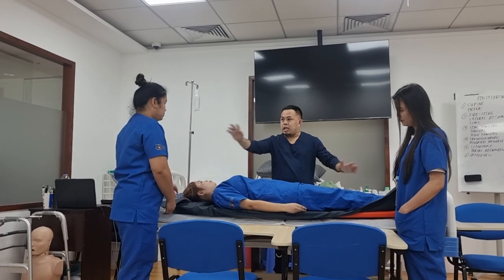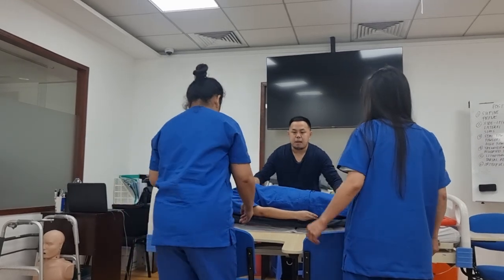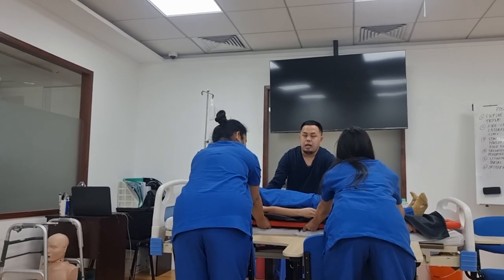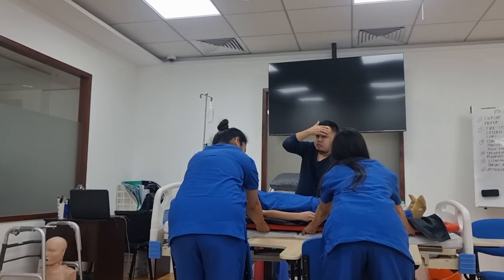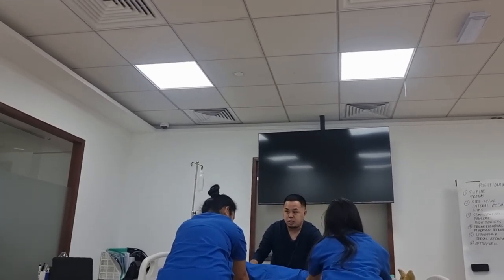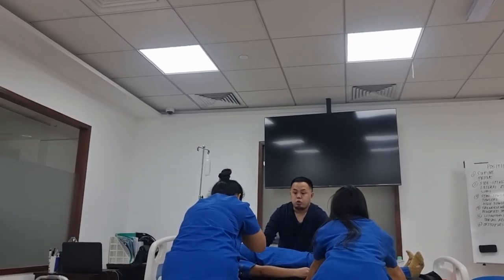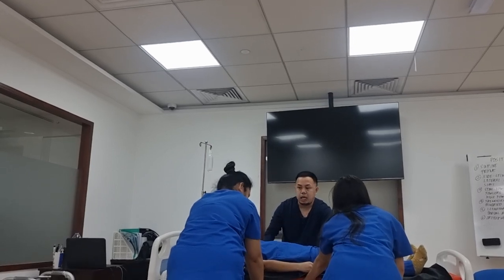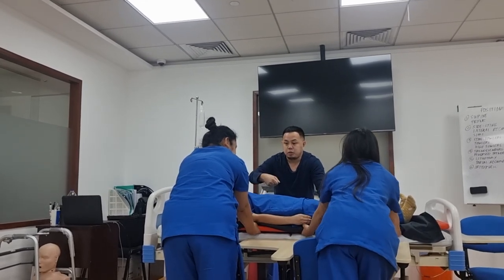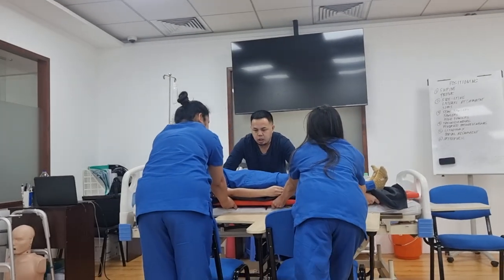Ask your colleague to stand on the other side of the stretcher bed and grab the board — not the sheets — so that on my count of three, we will slide the patient who is on the board towards the stretcher bed. You push, I pull. Count to three — one, two, three.